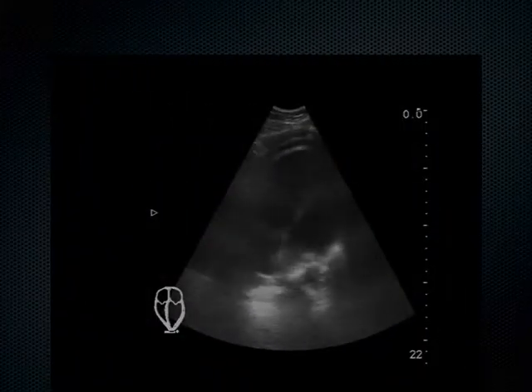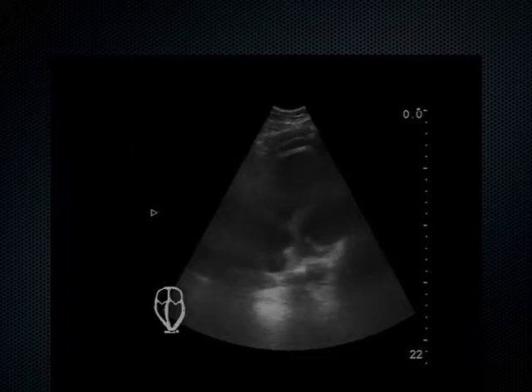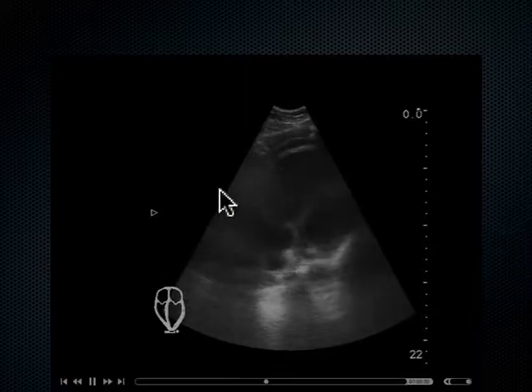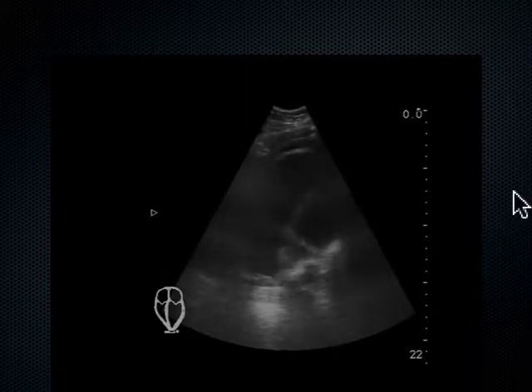This was an employee of the hospital who had an external fixation device on his leg, a 41-year-old male. He went home after orthopedic surgery. 2 days later, he came back in full-blown cardiac arrest, PEA. We're doing CPR on him, and we saw his heart with no pulse. Now, about 30% of the time, you don't feel a carotid pulse, but you actually see this amount of cardiac activity. This is called PCM, pulseless cardiac motion. It tells me the patient's still alive.